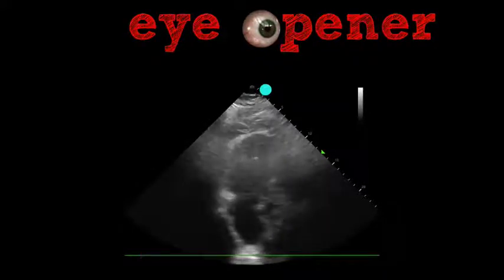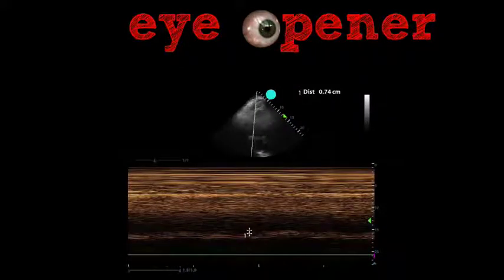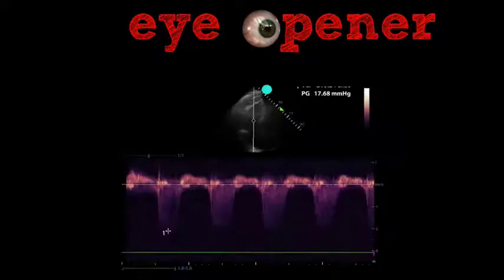And so if we put an M mode through that tricuspid annulus, we get something that looks like this and allows us to measure the back and forth motion of that annulus over time. And in this case, indeed, we had a TAPSE of less than a centimeter. Also, if we put continuous wave Doppler through that tricuspid valve, we were able to pick up a regurg jet.